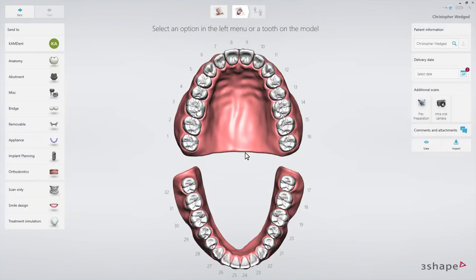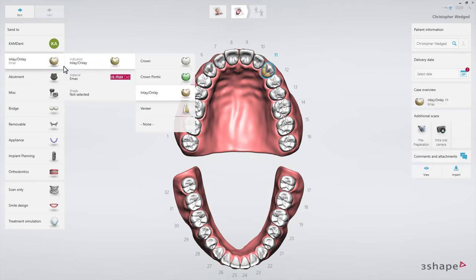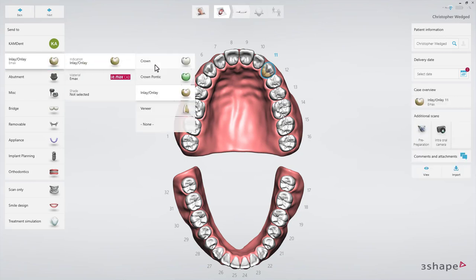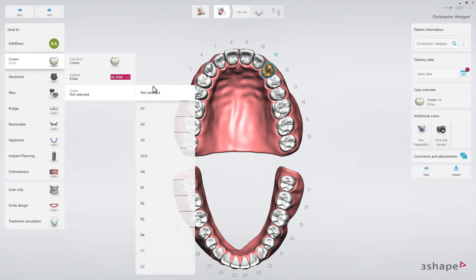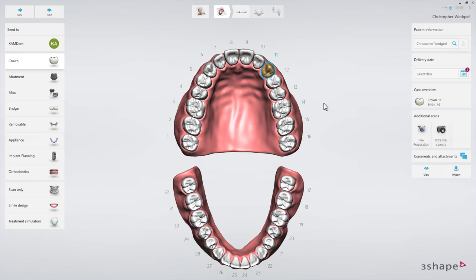Then fill in the order form. Select the tooth on which the restoration will be made, the indication, material, and other details. Set the delivery date.